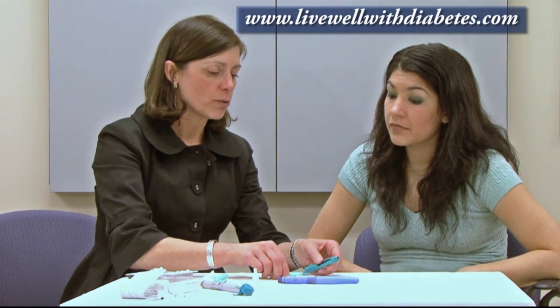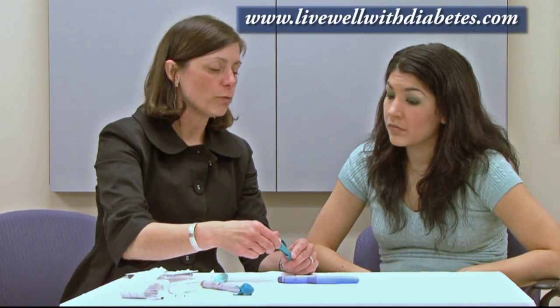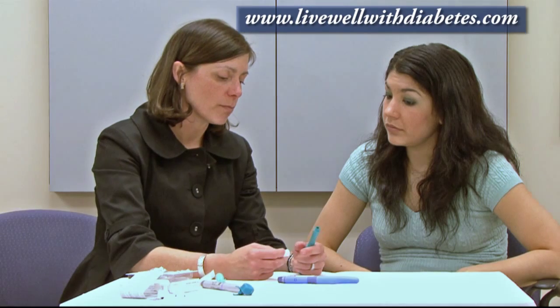When you're finished with the injection and ready to pull the needle out, you should remove the needle after every injection and only use the needle once. The reason for removing the needle after every injection is that insulin can end up blocking the needle tip and you won't get proper insulin delivery.